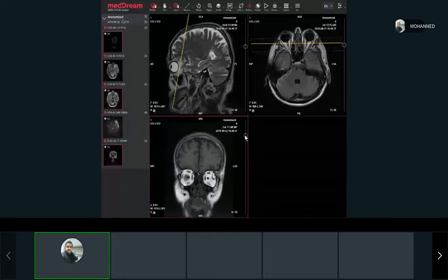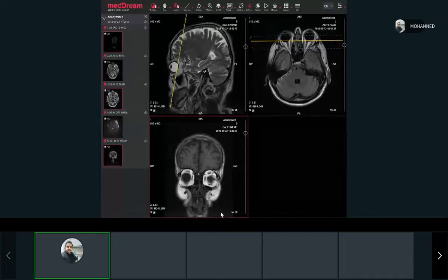Imagine that for a tooth. We can do that exactly, and we can capture the exact area that we want to look at and look inside of the root canal. A great tool that we can use.